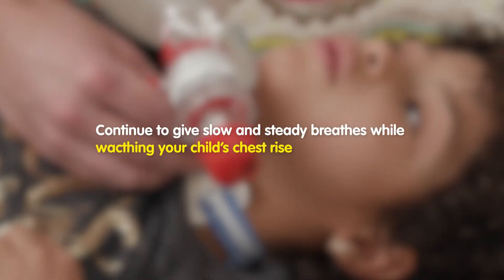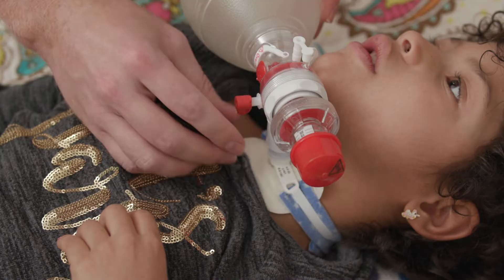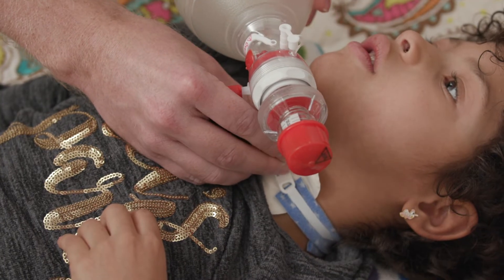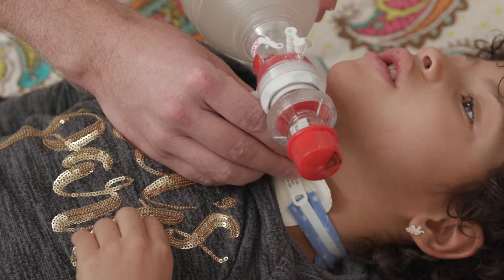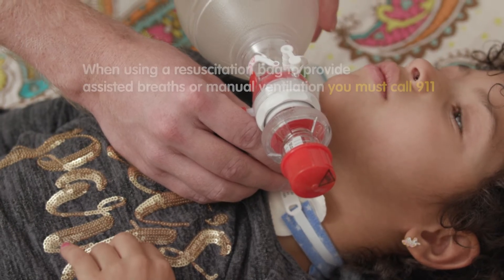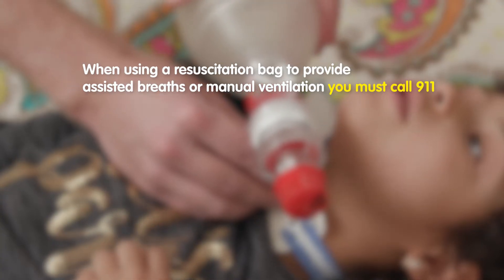Continue to give slow and steady breaths while watching your child's chest rise. This will ensure that the child is getting adequate ventilation. If the child is breathing on their own, it is best to coordinate by giving a breath as they begin to inhale or breathe in.